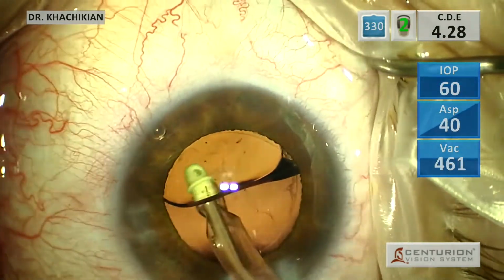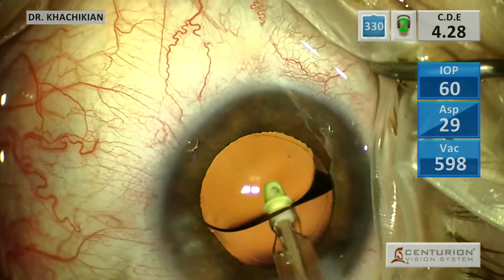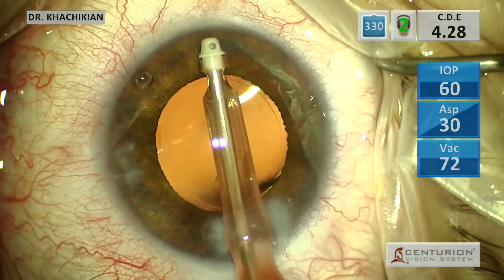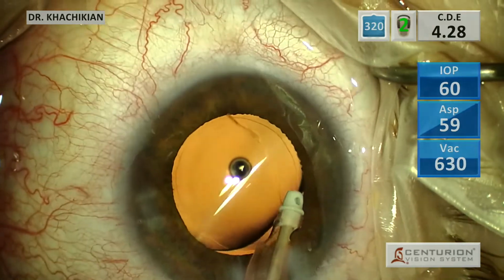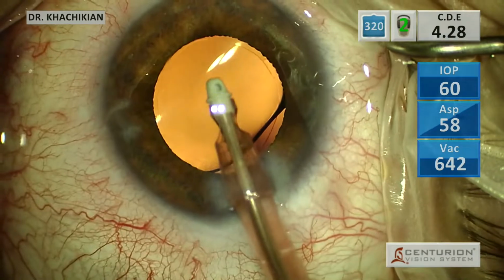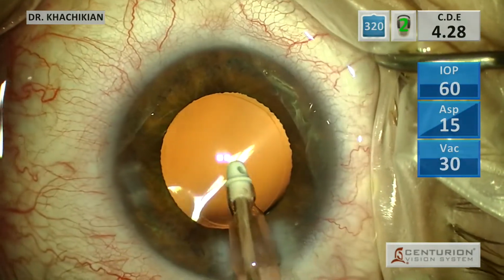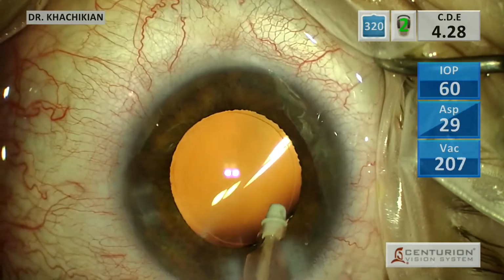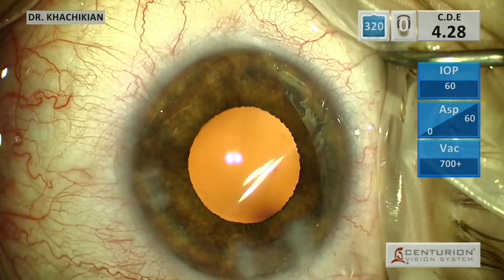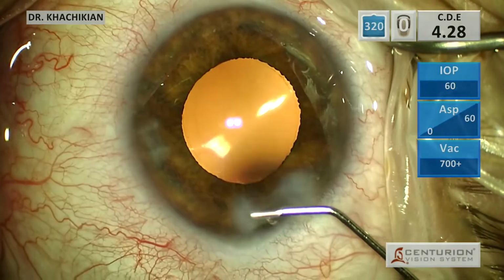I always go posterior to the lens to remove any viscoelastic back there, and then I will peripherally sweep both superiorly and inferiorly to make sure all of the viscoelastic or Provisc is removed. Once I'm fairly certain that there's no viscoat in the angle, I center the lens, possibly give it one more sweep depending on that, and then I will reinflate the eye and seal the incisions.